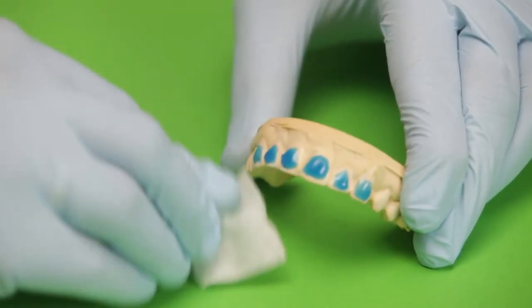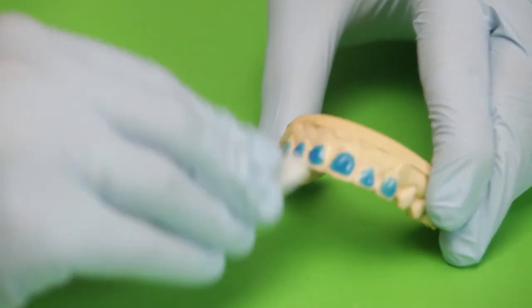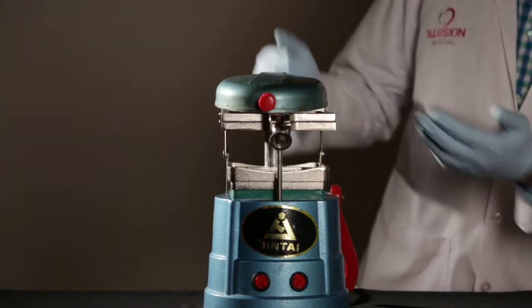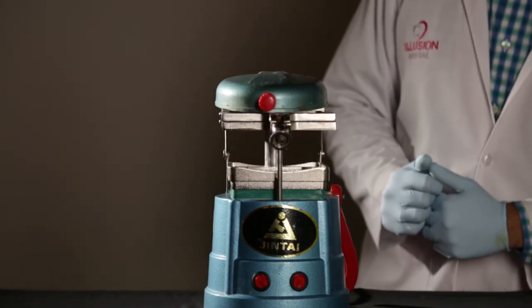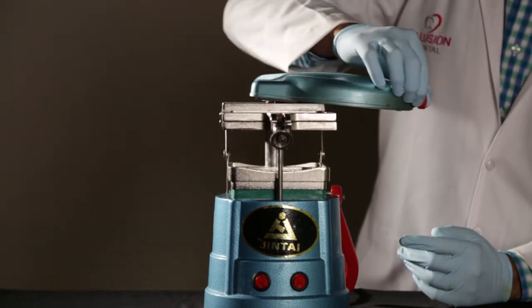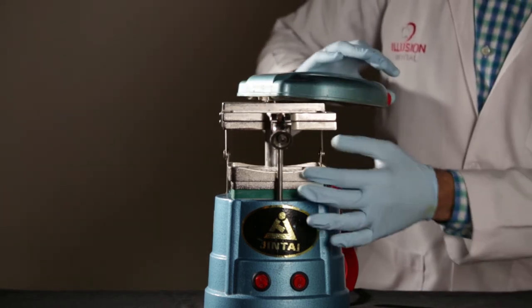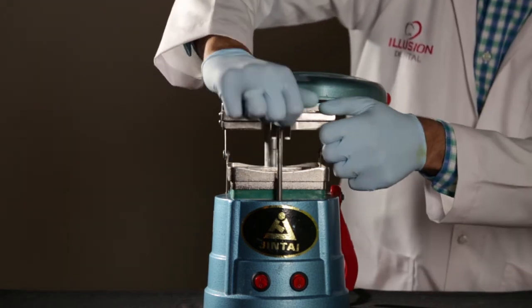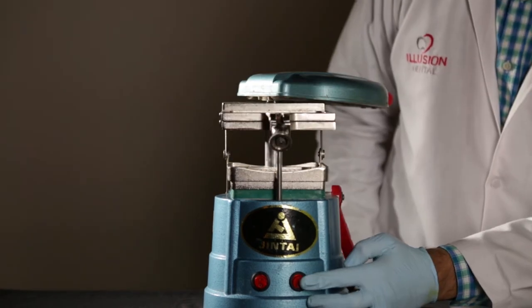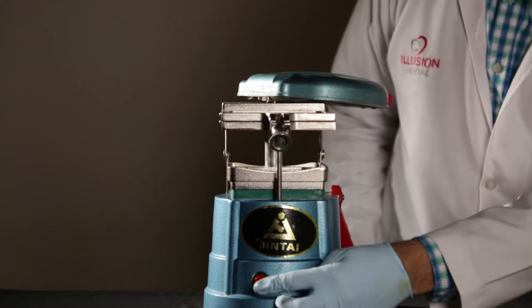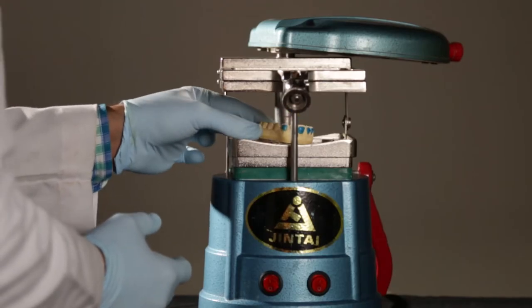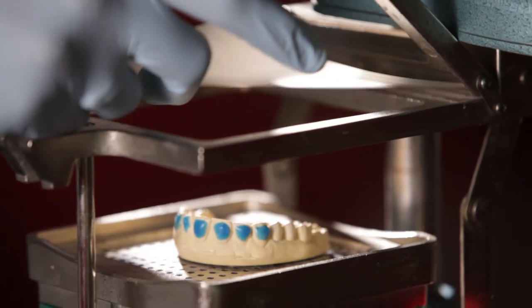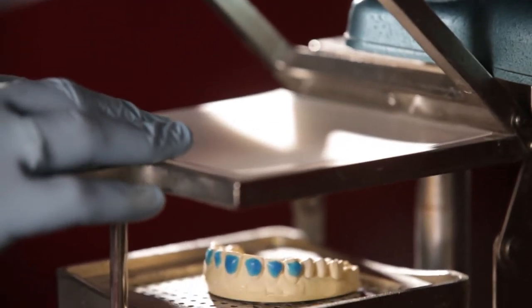Now this is what the vacuum former looks like. It has a heating unit on top and the platform where the cast will sit. It also has this frame where the bleaching sheet is positioned. It has two switches, one for the heater and one for the vacuum. We keep the model on the platform, and I've selected a soft bleaching tray sheet which I'm going to place in the frame and clamp it into place.